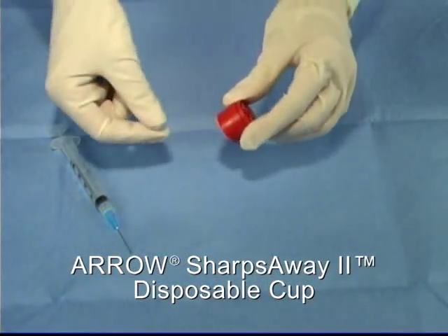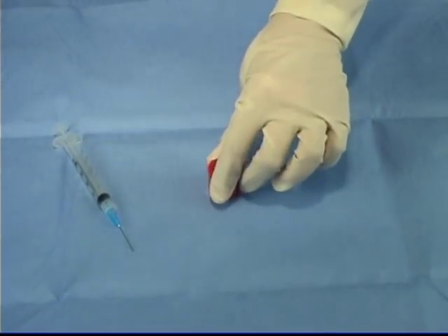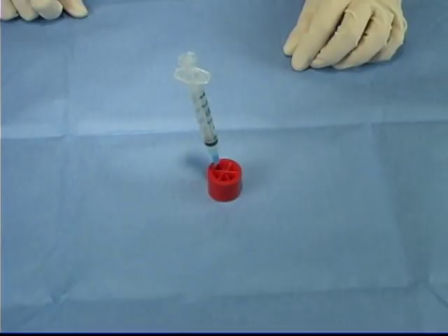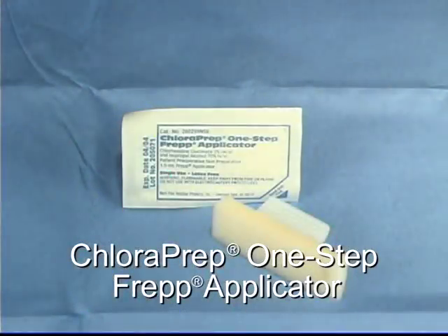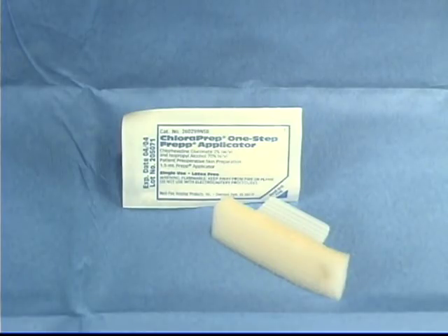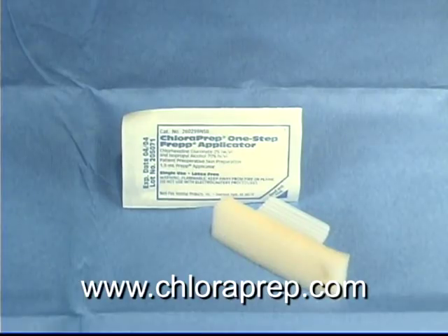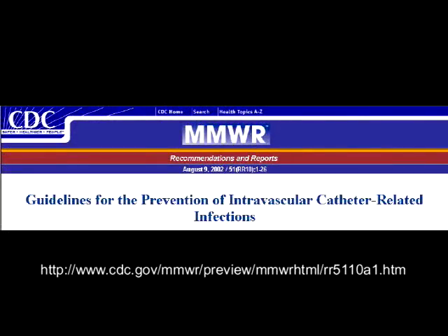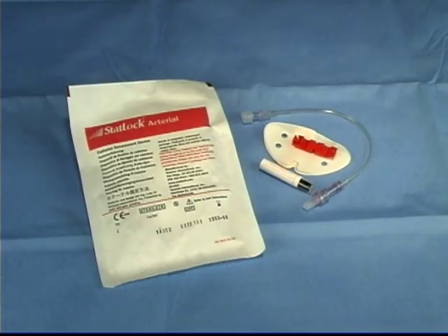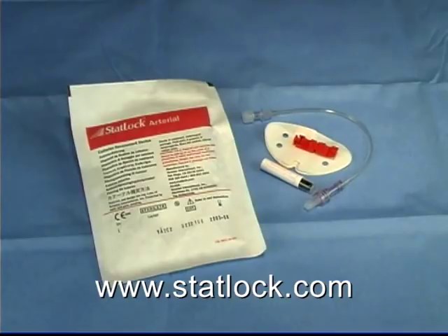The Sharps Away 2 operates much like a Chinese finger trap. After a needle is inserted, it is possible, although quite difficult, to remove it. One should never attempt to remove a sharp object from a safety device — if a needle is inserted and removed, the needle will be damaged and not usable. The Chloroprep one-step prep included in the arterial safety kit meets the CDC 1A recommendation for proper skin disinfection; for technical information, please visit www.chloroprep.com. On August 9, 2002, the CDC published guidelines for the prevention of intravascular catheter-related infections; the full text is available on the CDC website. See the CDC guidelines for commentary on the advantages of catheter-securement devices over sutures, or visit the manufacturer's website at www.statlock.com.